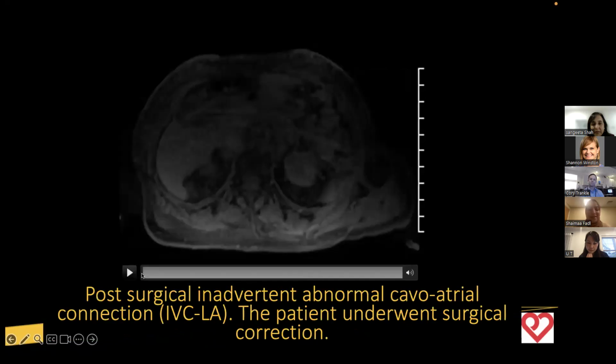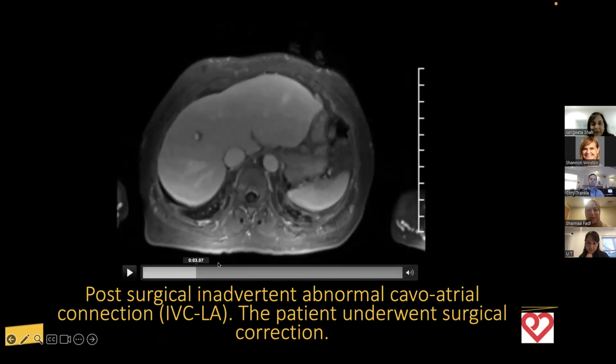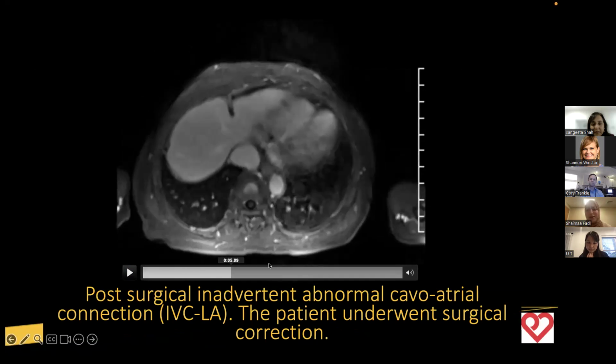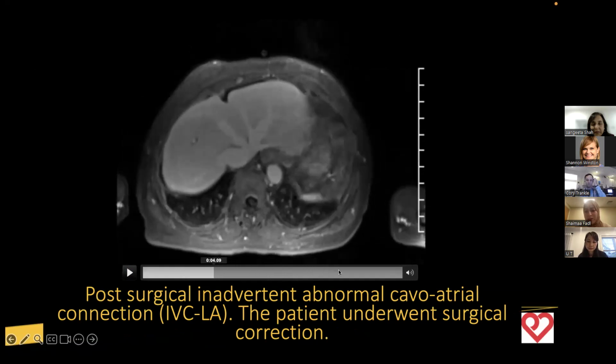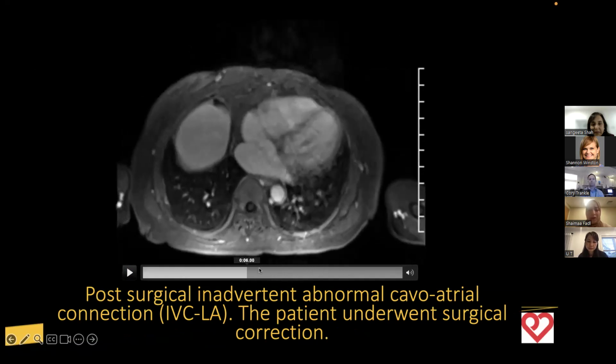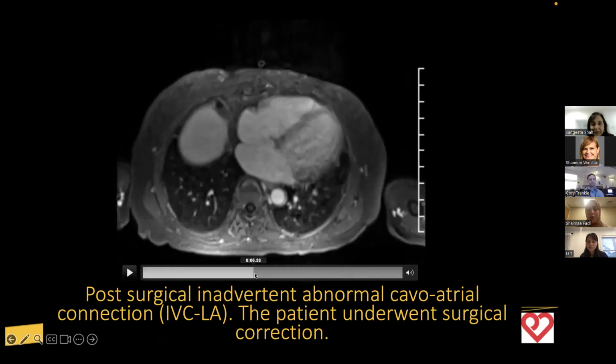And this is the post-contrast T1 VIBE. I find it's really helpful in showing the anatomy. And this is the IVC connecting to the left atrium, with huge enlargement of the left atrium and left atrial appendage. There is no residual interatrial septal defect in the previous images.